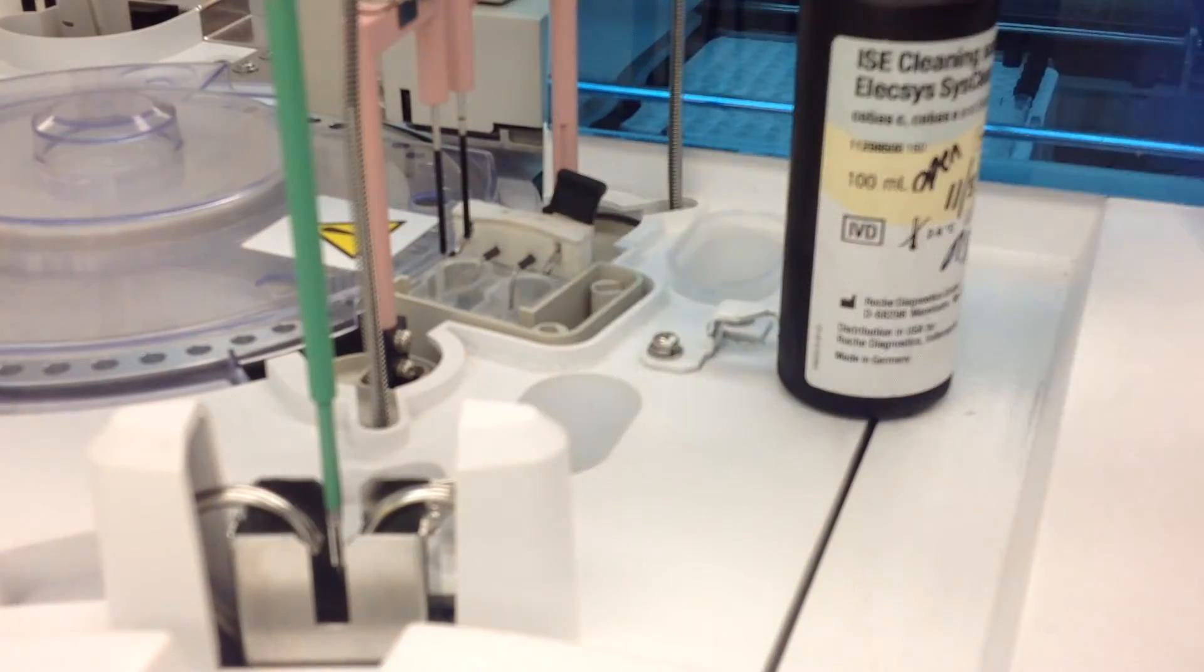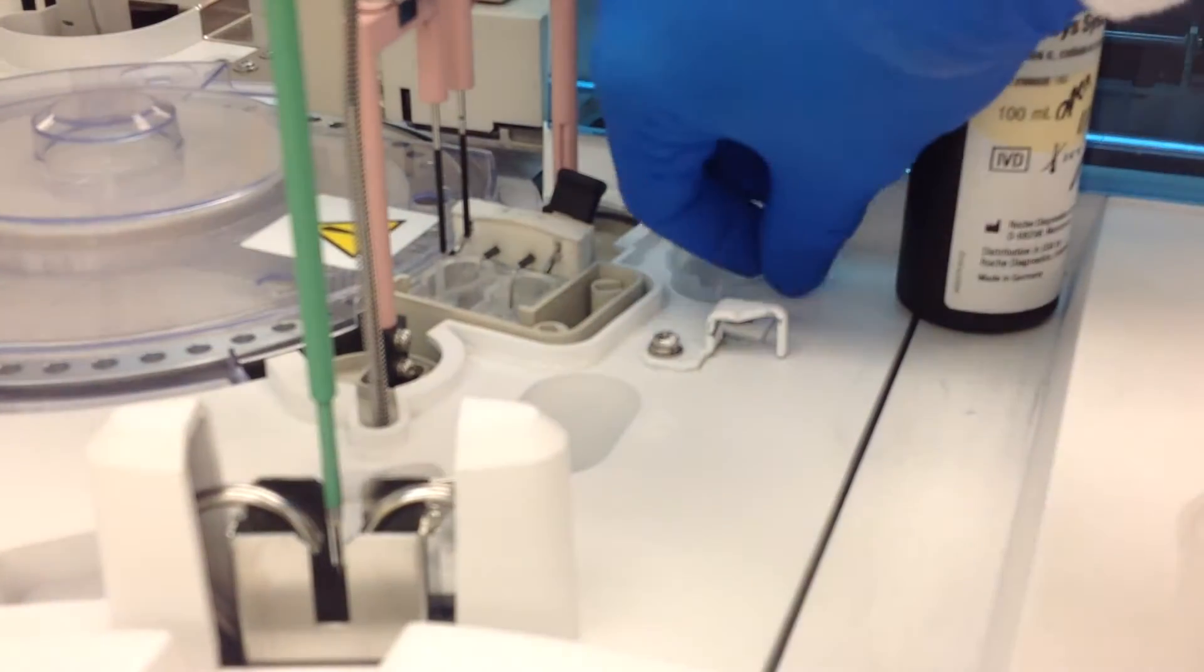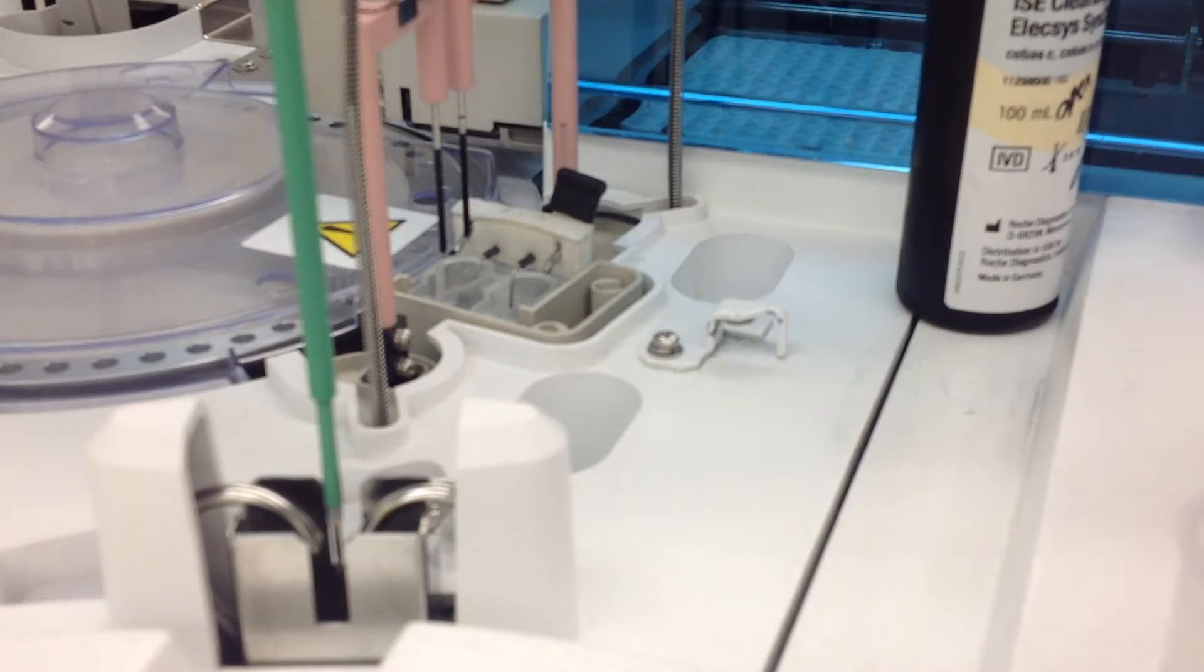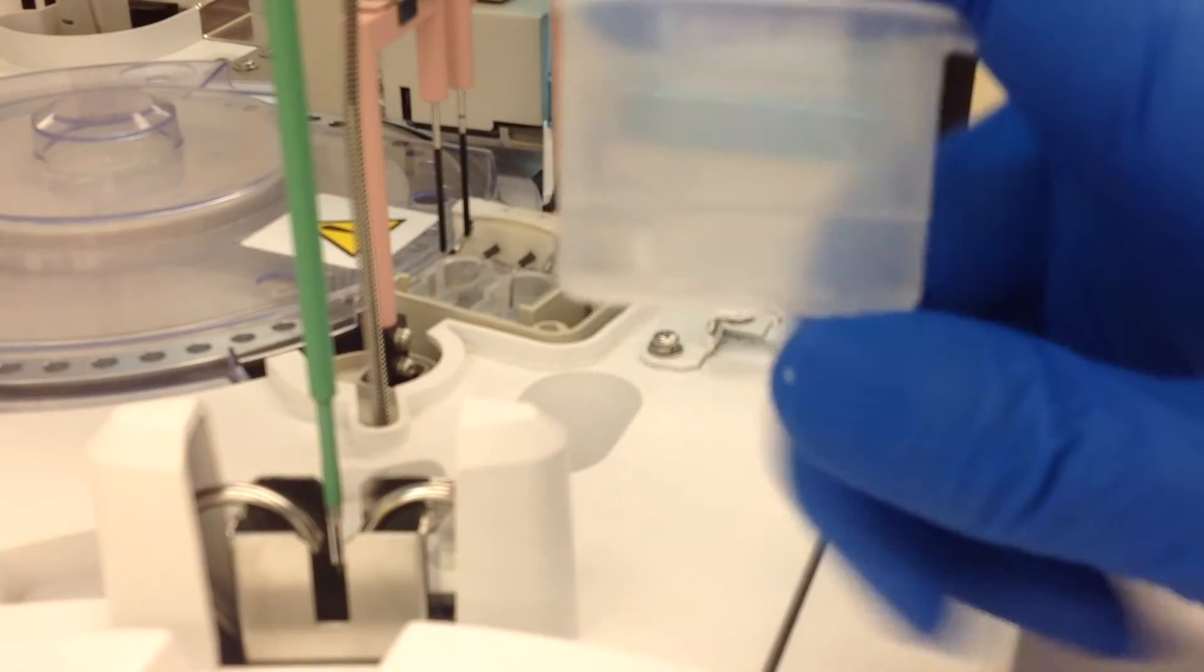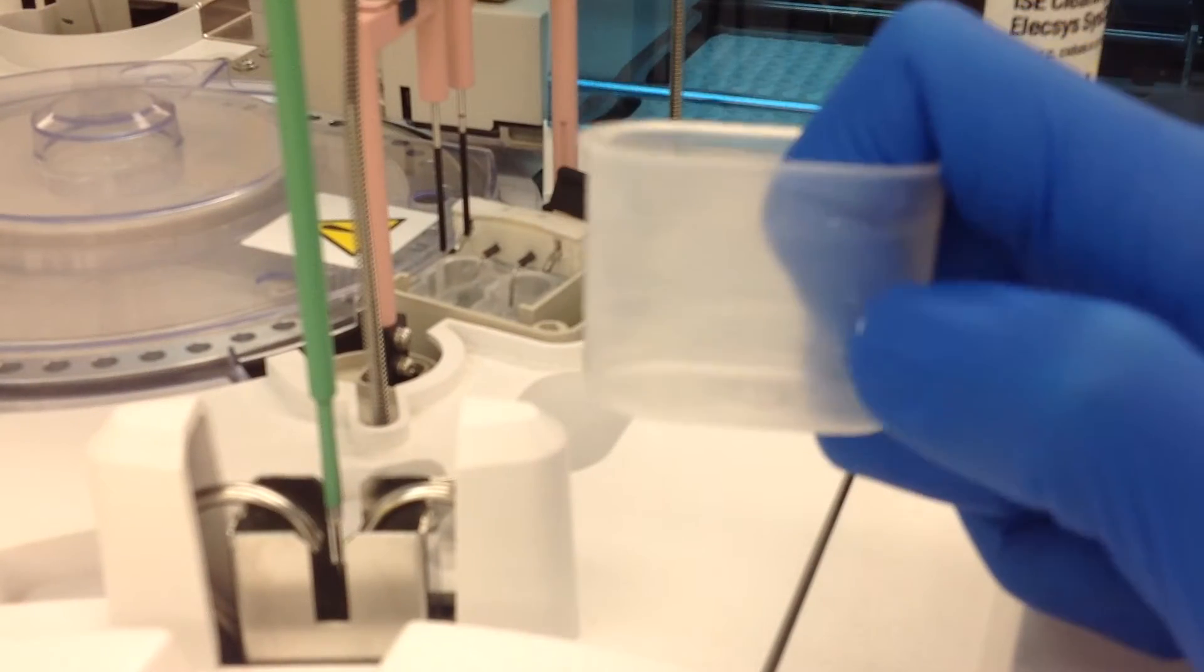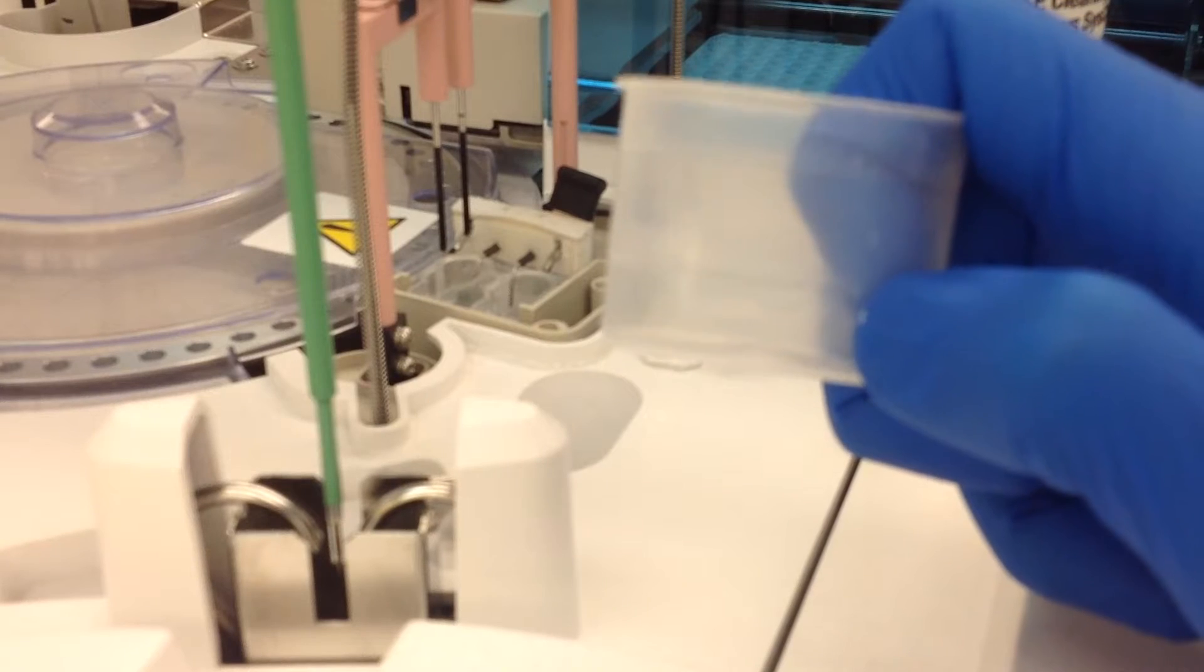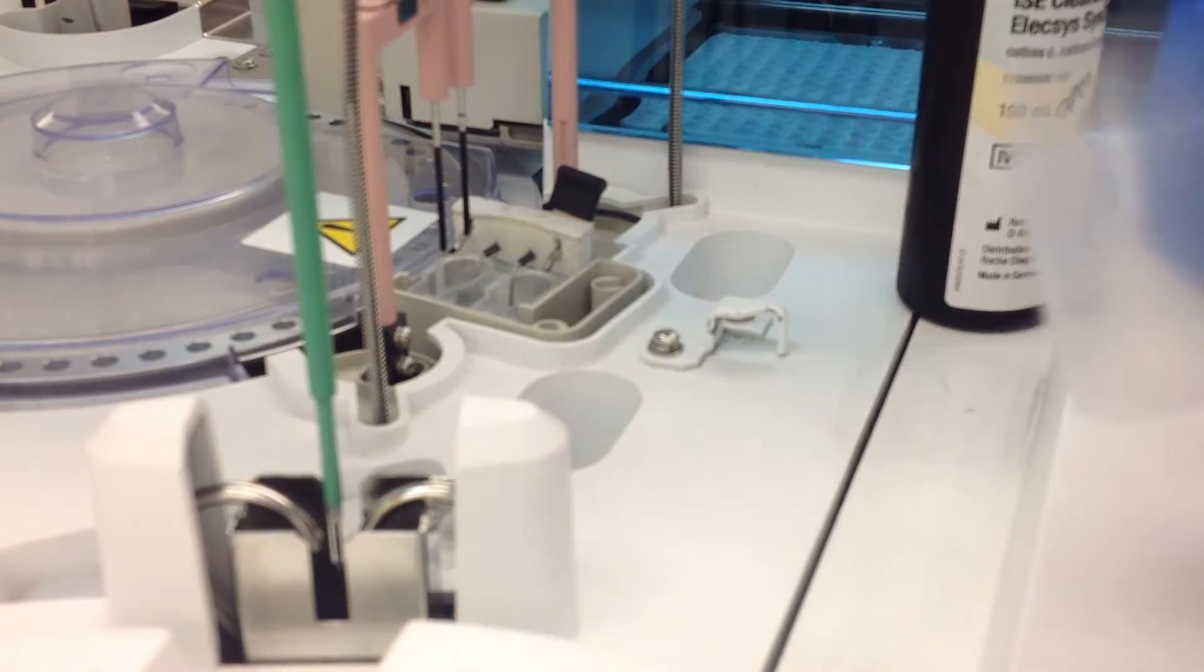So you take out these two little containers here, and you see how they have these lines on them. And you're going to fill up Sis Clean to the first line.